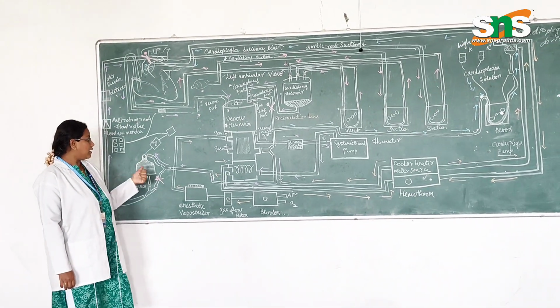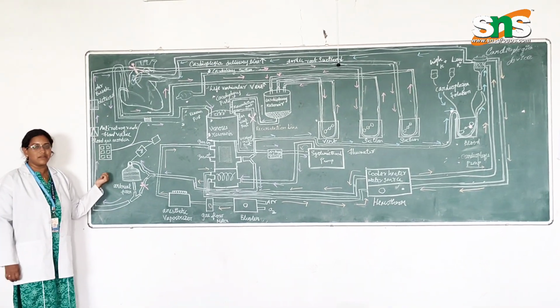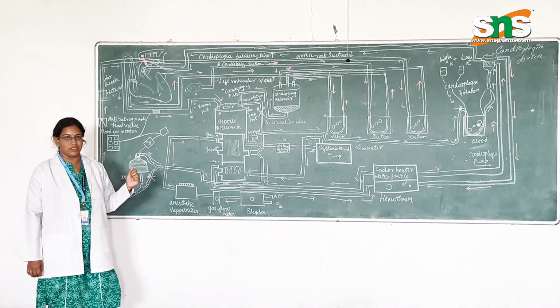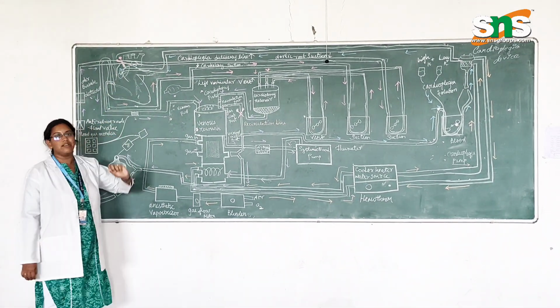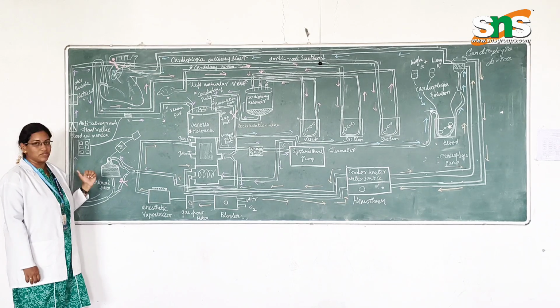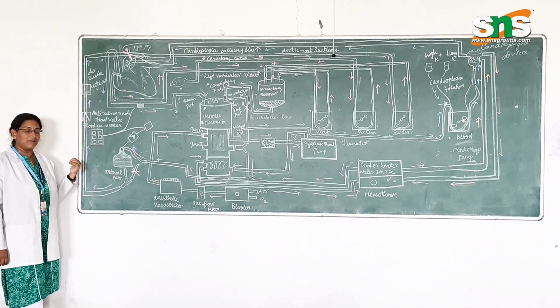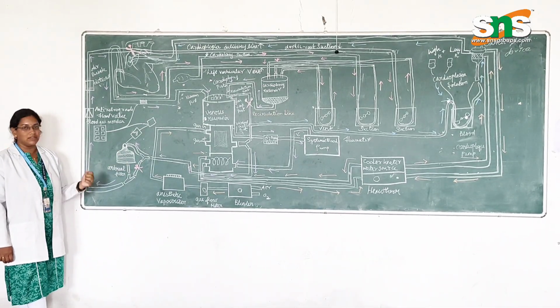So it is important to measure the line pressure periodically. The line pressure should be 100 plus or minus 10 mmHg. On bypass, it can go up to 150 mmHg. When the line pressure increases, it can directly cause damage to the aorta. The aorta can get ruptured. So to avoid all these consequences, maintain the line pressure every day. Monitoring the line pressure will automatically give the status of the arterial filter.